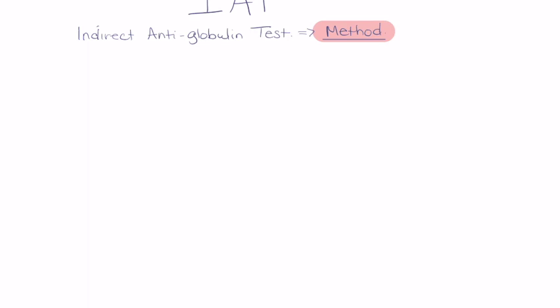First off, we will use it for a weak D, slightly modified with the weak D. We will use it for an antibody screening test. So your antibody screen, we will use it for. We'll use it for a full cross match. Okay. There are different cross matches that we'll use it for.